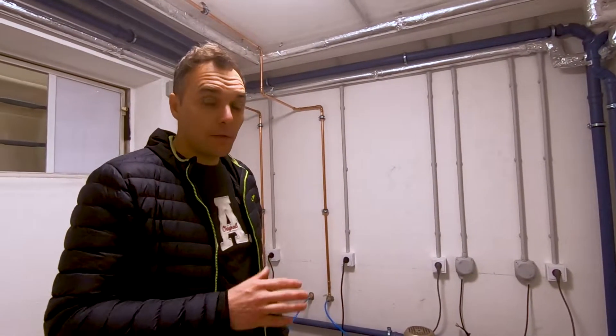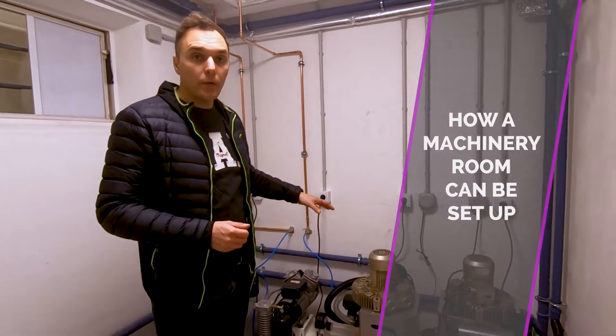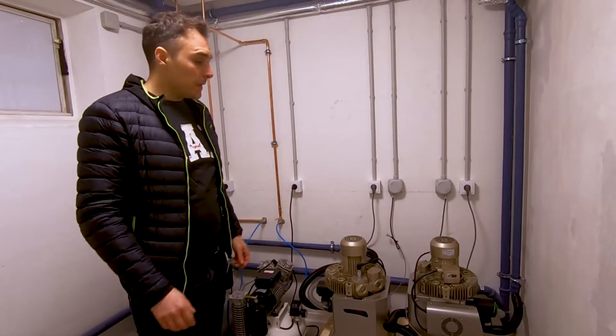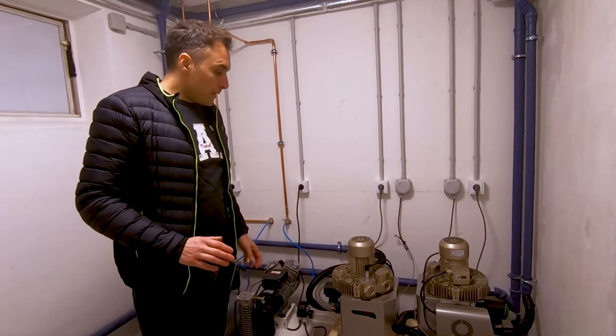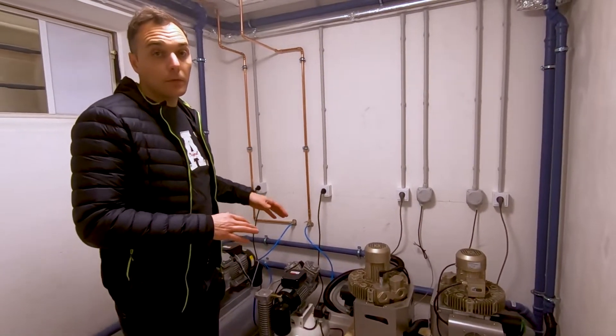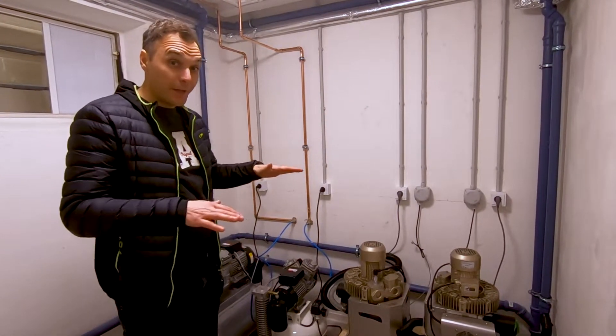Hi everyone. In this little video I want to show how we set up the suction and compression system in the machinery room. We are underground, so the clinic is upstairs and here is the level lower.